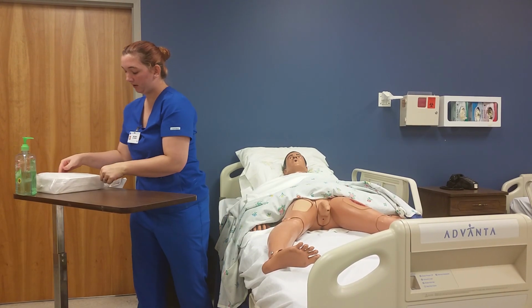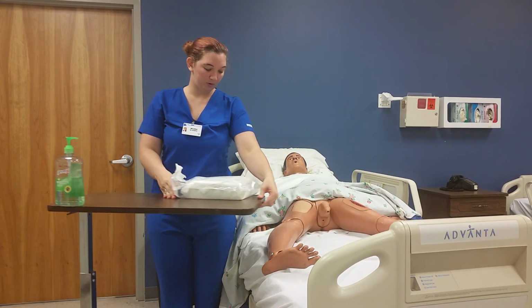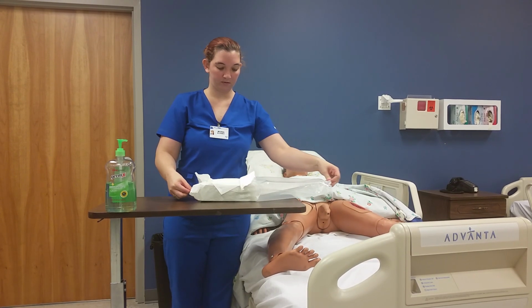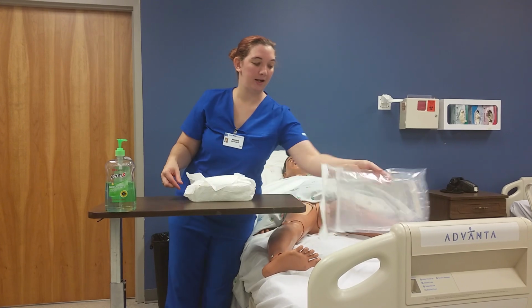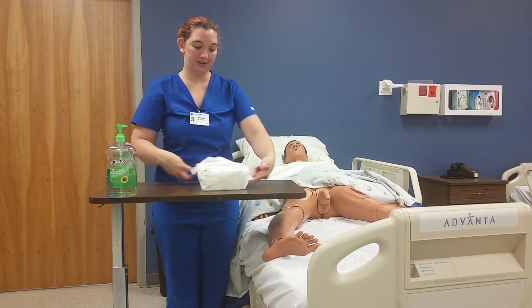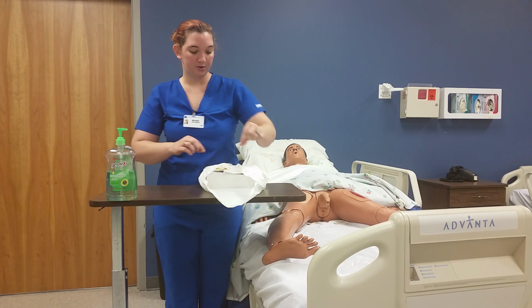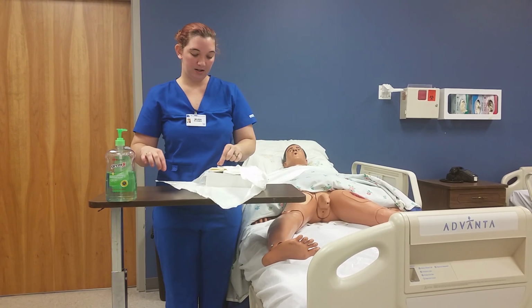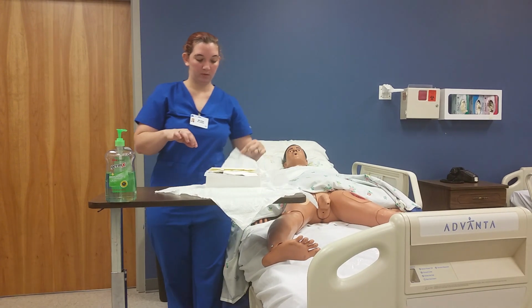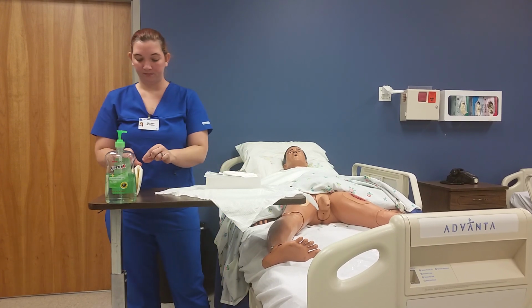I'm going to move this over here. And we're now going to open up our catheter kit. Move the table. I'm going to put this bag at the end of the bed and we'll use it for trash later. I'm going to turn this so I can open it away from me. Just the outer corners. Open this side. Open this one. And pull back. I'm going to take my gloves out. Place them here.